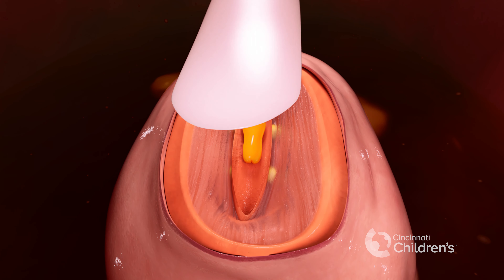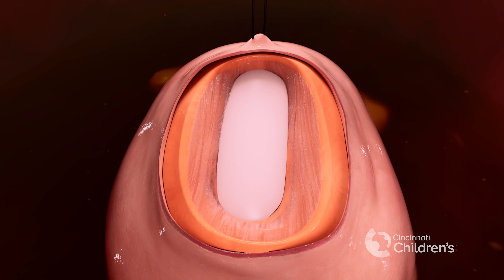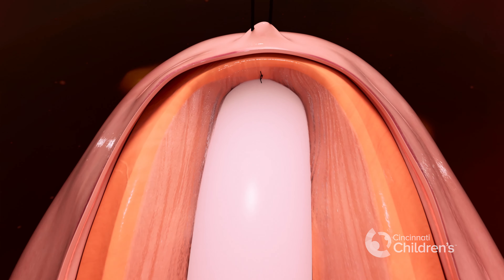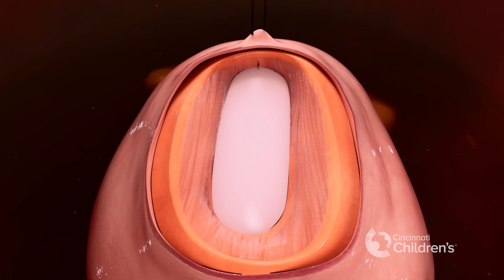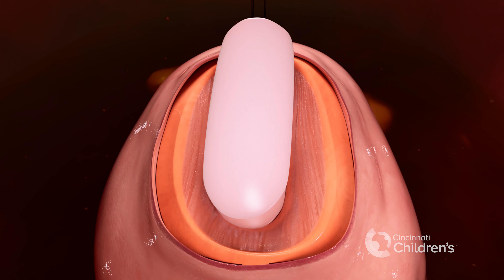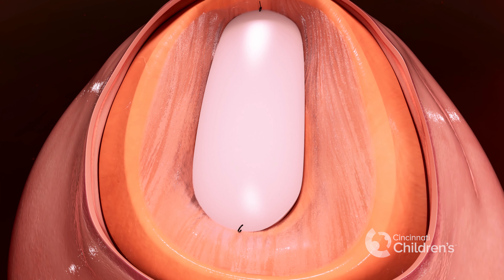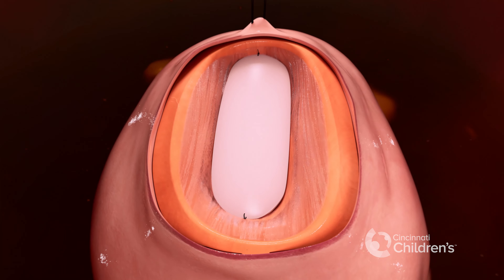To protect the placode, we place a patch into the defect. We anchor the patch on one end to the baby's back using dissolvable sutures. A second patch is then placed to give additional protection, and again it is secured with dissolvable sutures.